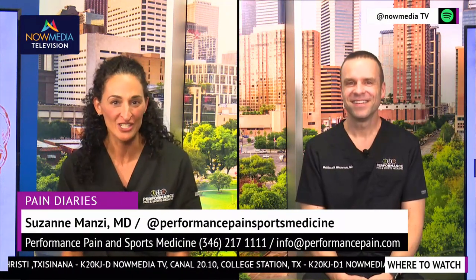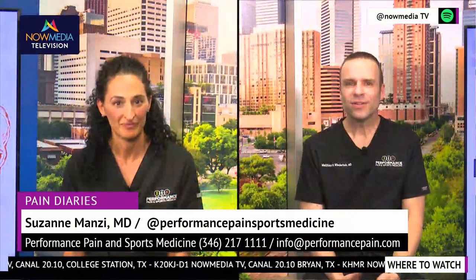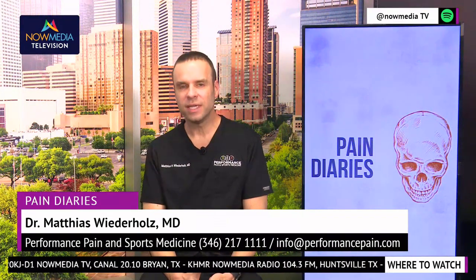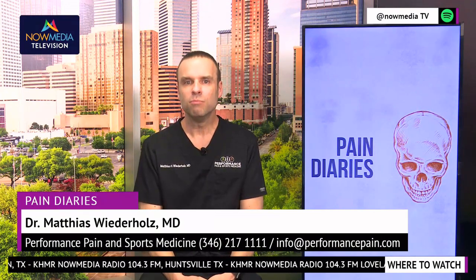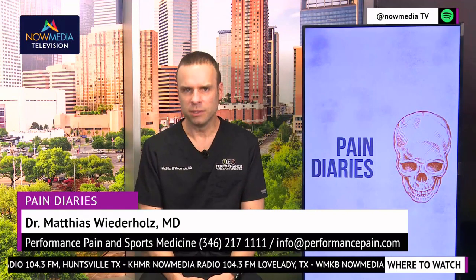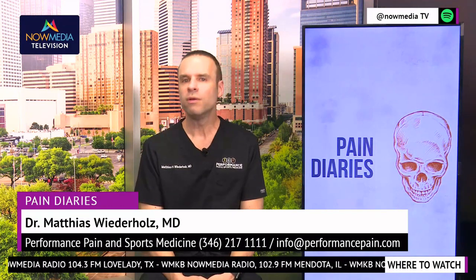Are there any restrictions or precautions that patients need to be aware of after receiving the Medtronic spinal cord stimulation device? Yeah, there are definitely some restrictions. Immediately after surgery, we don't want you bending or twisting very aggressively. And the reason for that is basically you want the device to scar in place so that it doesn't move. And so those restrictions are in place for a period of about 3 months.